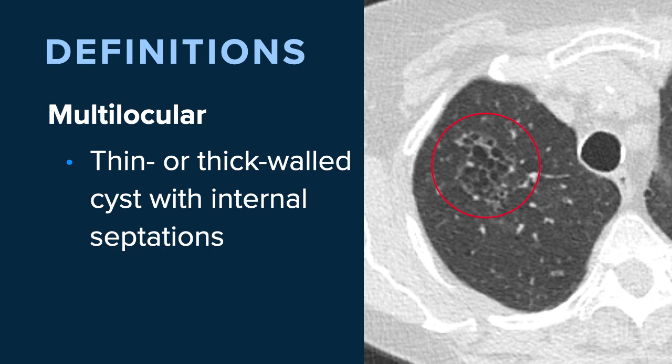Multilocular cysts — thin or thick-walled cysts that have internal septations are considered to be multilocular. You may have one or two septations, or as we see in this example, there are numerous or multiple septations. These are complex lesions and are more suspicious at lung cancer screening.